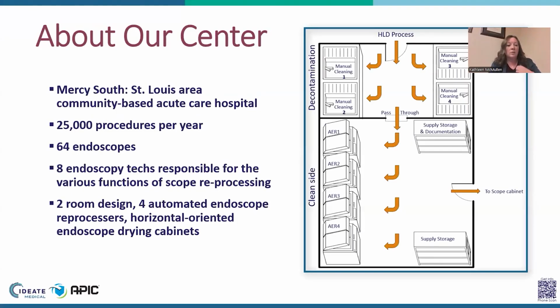All right, so about our center, this was at one of our hospitals in urban St. Louis County, a large endoscopy center. We do about 25,000 procedures here per year. We have 64 different endoscopes, primarily Olympus. We had 8 endoscopy techs who are responsible for all the scope processing that were involved in being trained into this technology. And as you can see in this diagram on the right, we have a 2-room process.